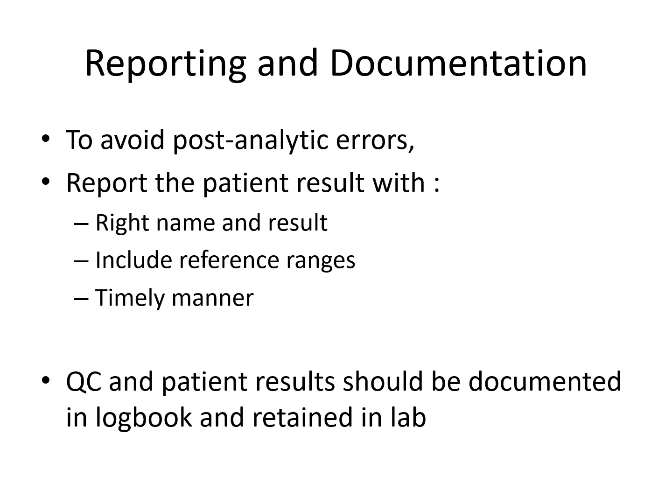Right, documentation. So this is to avoid post-analytic errors. We make sure that the correct information is encoded or reported, and we should keep this record in the laboratory for a significant amount of time.